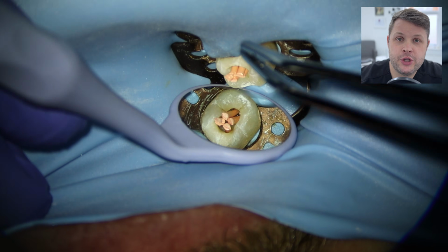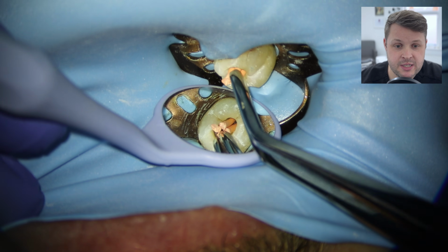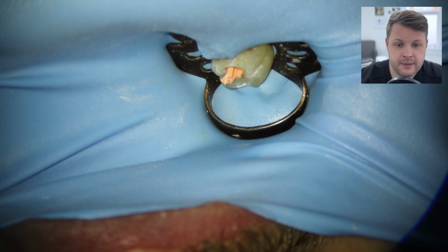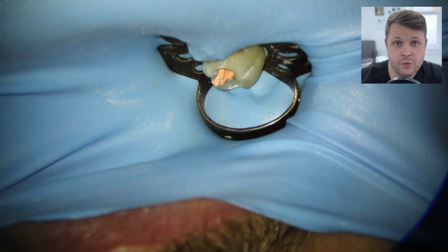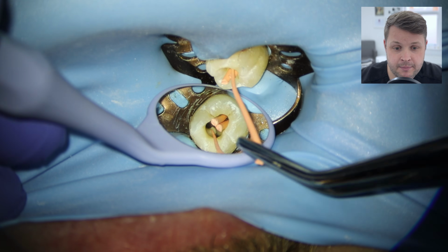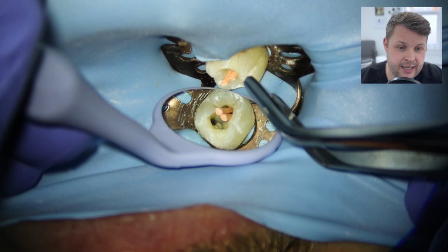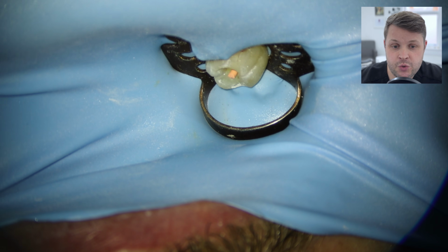And then we're ready for the obturation. And again, this is essentially what the video is about, my obturation protocol. Basically what I need to do now is disinfect these GP points. So I am going to remove these GP points, and then put them in a GP disinfector. You can use whatever you like.